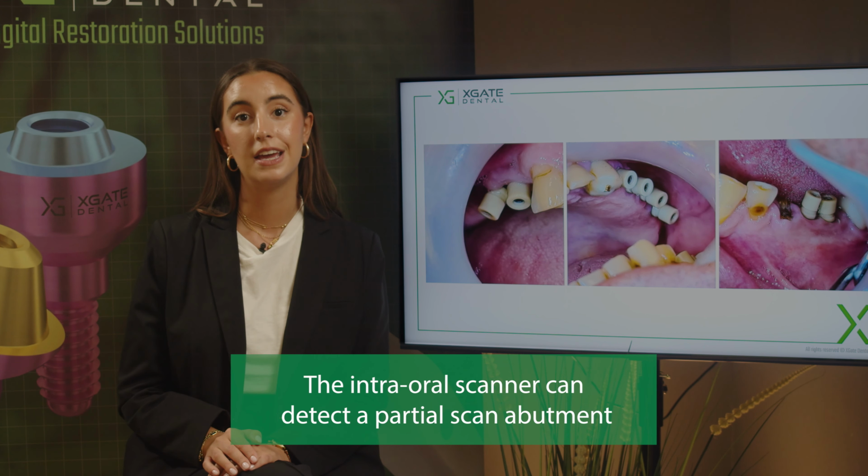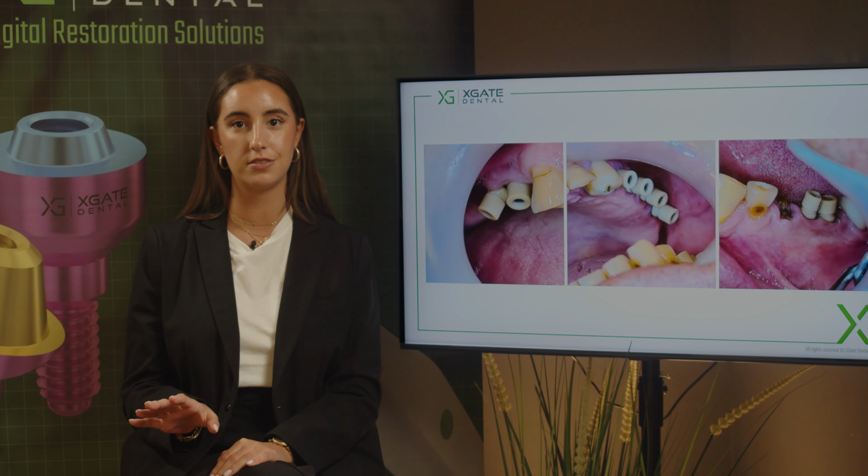Sometimes when you make single crowns on single implants, the scan abutment varies in height, and it can be very large. If the angulation of the scan abutment is incorrect, you'll have a problem with the proximal tooth, and you want to cut part of the scan abutment. It's also a possibility. You can cut the scan abutment and still take impressions and scan in the program. You won't have any issue in the design process.